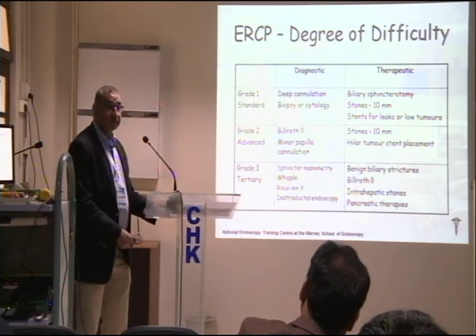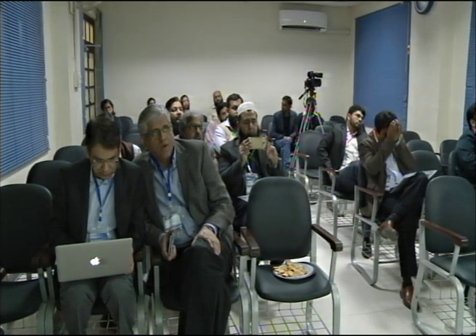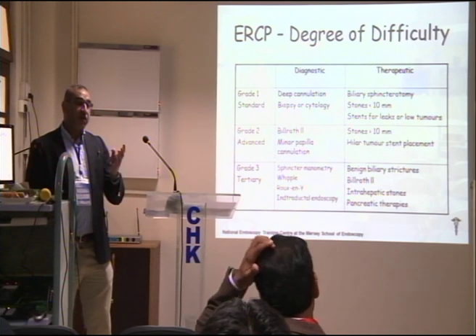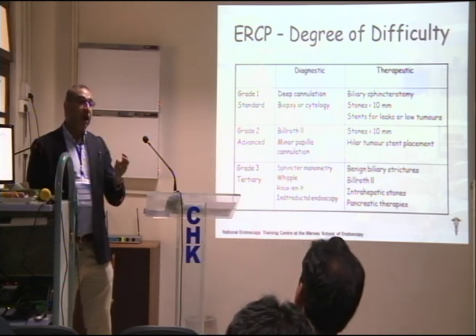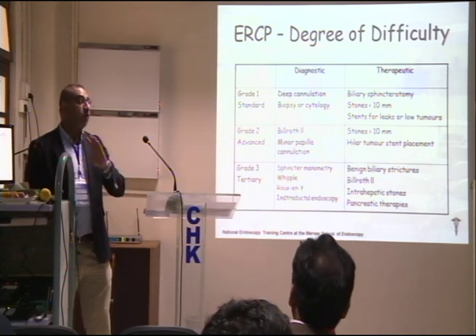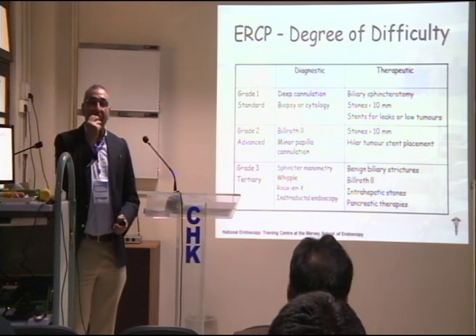Sir, what about sphincteroplasty? Sphincteroplasty, again, it's an advanced procedure. I wouldn't recommend you people doing it. Because you are disrupting the sphincter, it is a major procedure, and it can cause major complications like bleeding. You can tear the duct, and you can cause pancreatitis. The risk is very high in sphincteroplasty. I wouldn't do it. It says grade 2 advanced stones more than 10 mm.